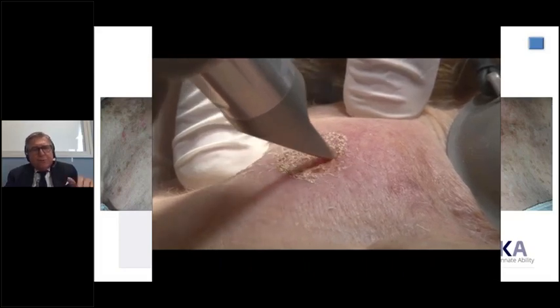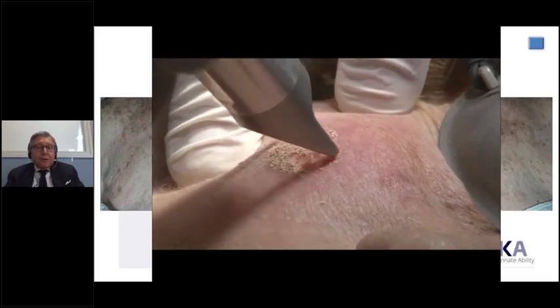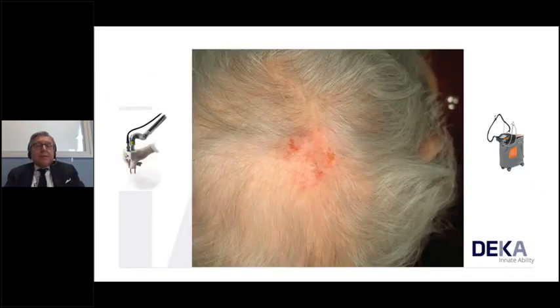So we treat with a free hand, but we can even treat with a fractional. The fractional CO2 is capable to renovate the skin even at the molecular level, because sometimes we treat with the fractional even décolleté and the face, normally with the purpose to improve the cosmetical appearance.